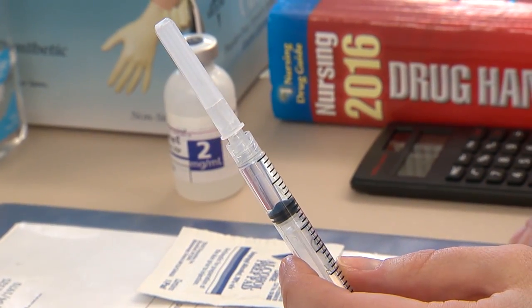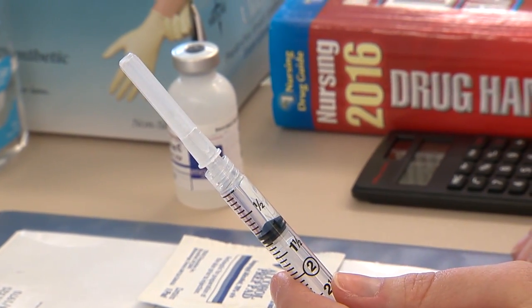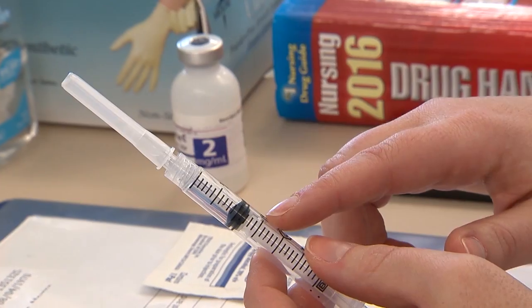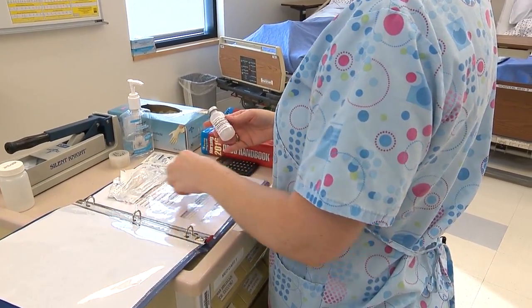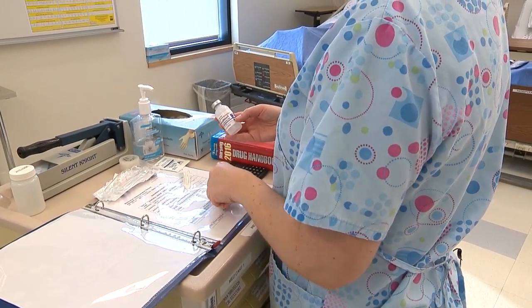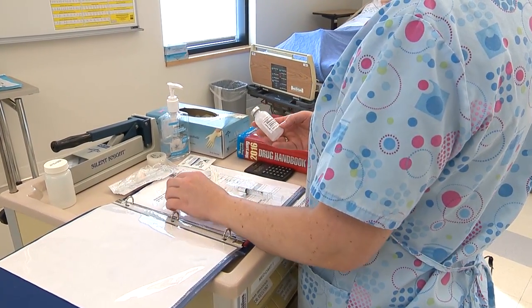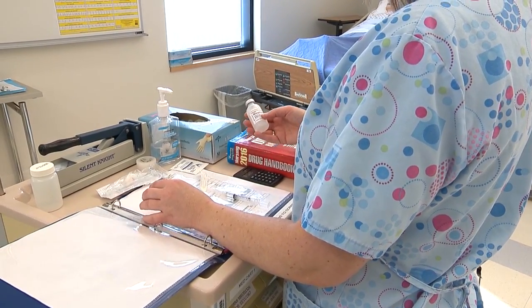If I were giving more than one medication at a time, or not administering this medication immediately, I would want to label the syringe with the patient's name, medication, dose, and time. So again, I have morphine sulfate 2 milligrams per ml. I drew up 1 ml to make 2 milligrams. Expiration date 12-20-50, for Morgan Brown, date of birth 8-4-70, no known allergy. The time is now and the day is today. I'm now going to go to the room and administer the medication.